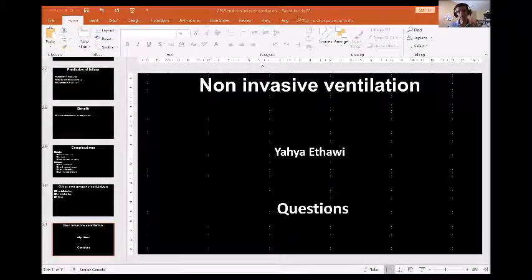I was also asked about a ventilator having a compressor, or CPAP having a compressor. On CPAP and PEEP: CPAP is a pressure above atmospheric pressure. So if you put any pressure above atmospheric pressure in the nose, that is CPAP. PEEP is the pressure required to keep alveoli open. And PEEP is of two types, the provided and the measured.